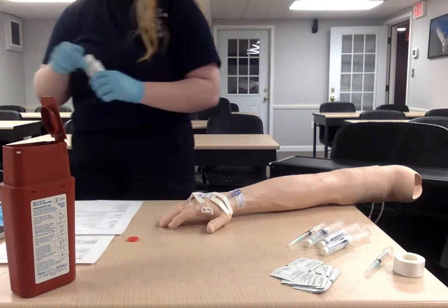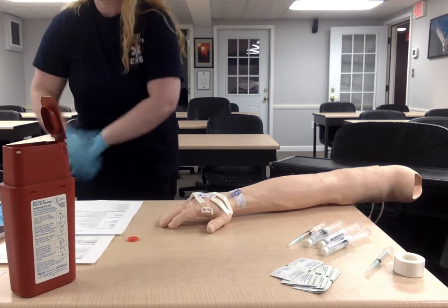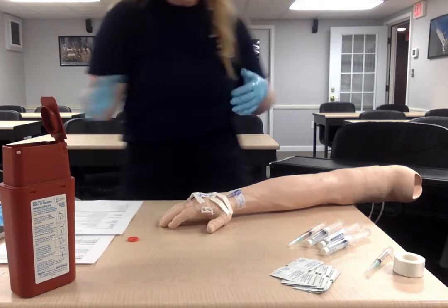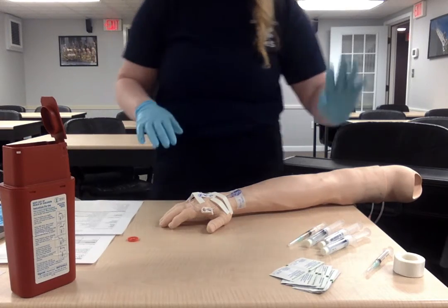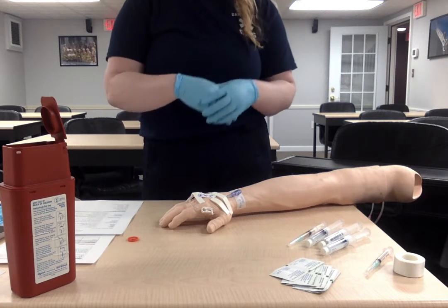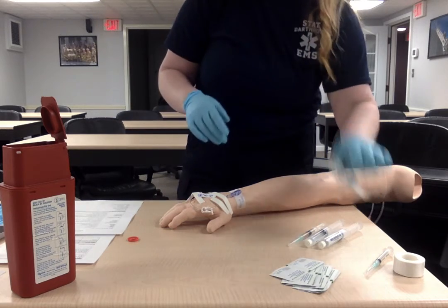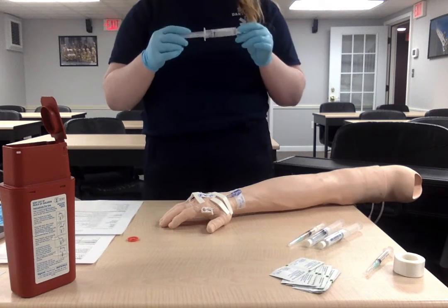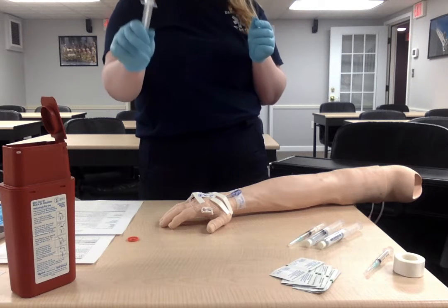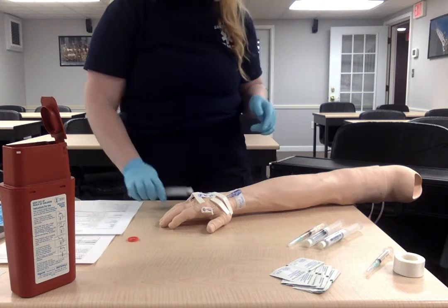So again, hand hygiene, because we're going to start dealing with stuff. Again, new gloves are put on at this point. So now we're going to come over to the IV. We have some 10 mL flushes in order to make sure that the line's patent, as well as so we can flush the rest of the medication through. So again, make sure it's normal saline, 10 mLs, because that's what's called for. We want to make sure that it's clear, no particulate matter, and check the expiration date. The cover's on here so we know that it's sterile.